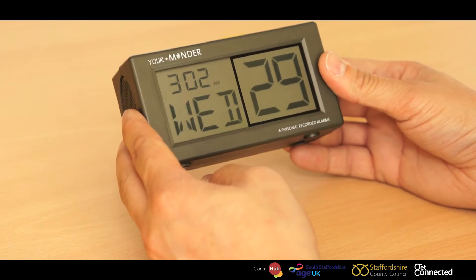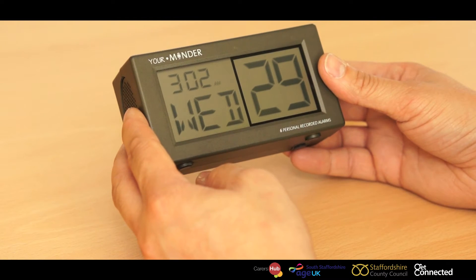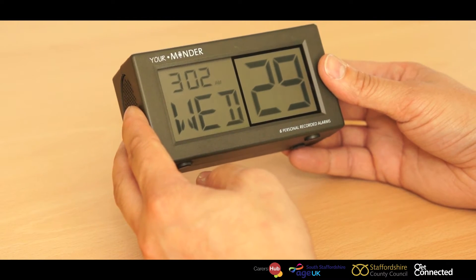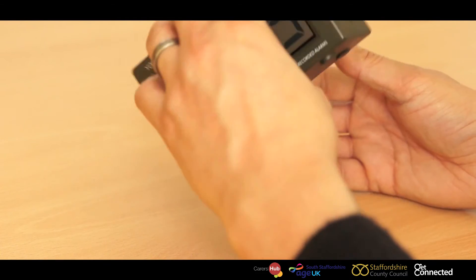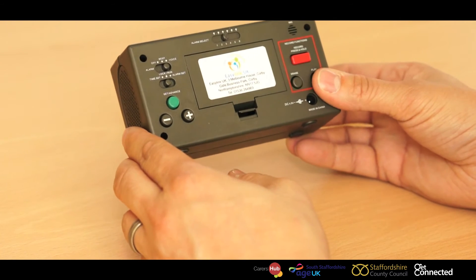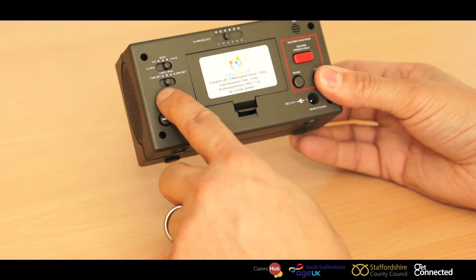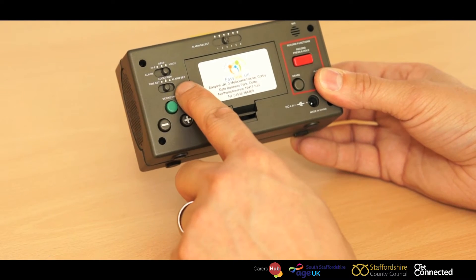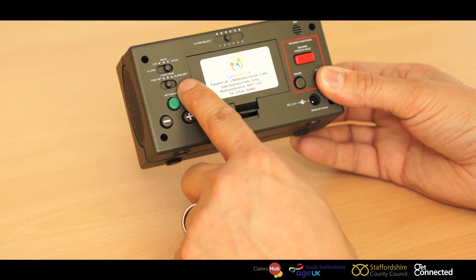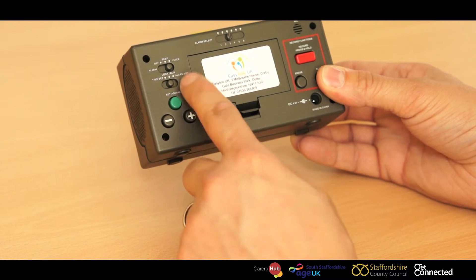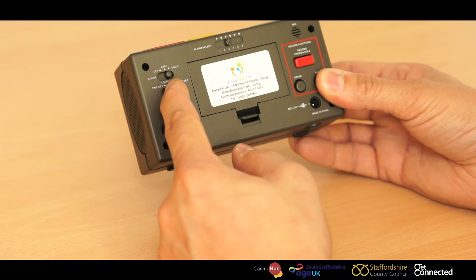Now what we're going to do is set an alarm prompt. So spin your minder around again and this time, instead of set time, you'll notice there's a button that says alarm set. We now flick that to alarm set.